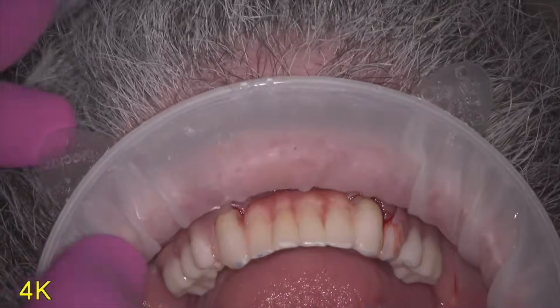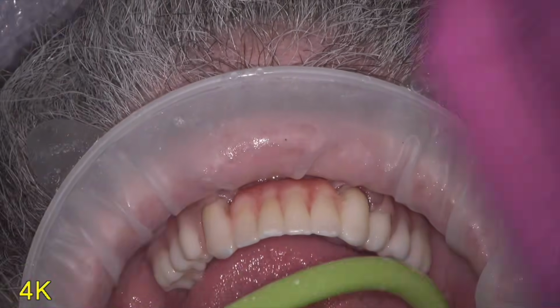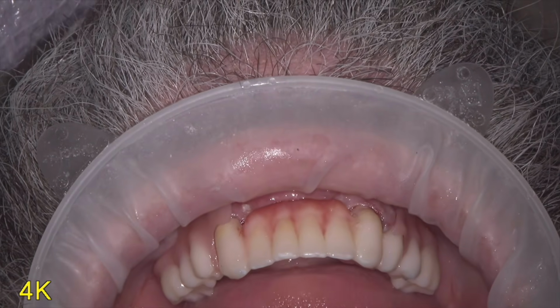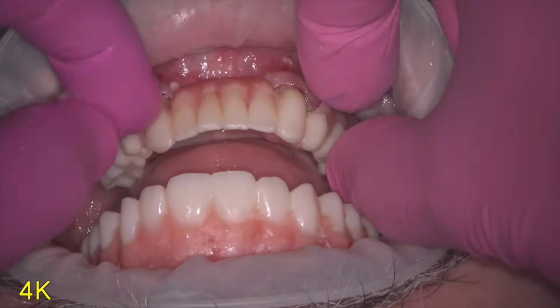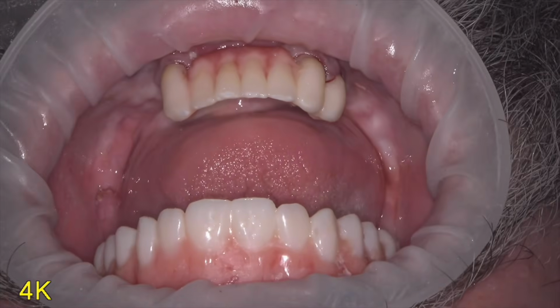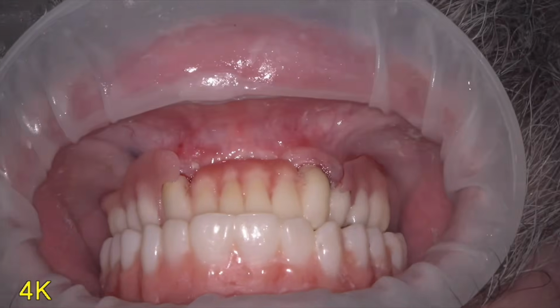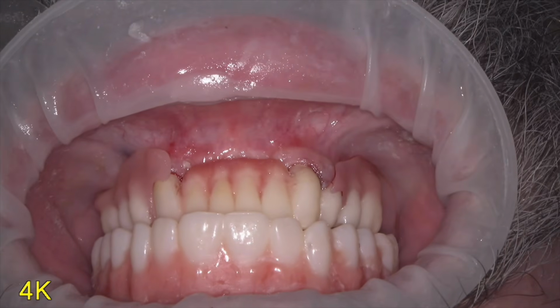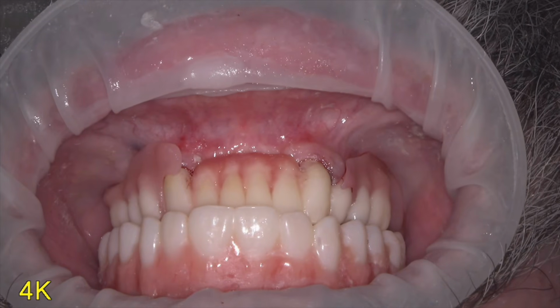Check the occlusion, and everything is beautiful. And I'm going to tell you, he was not expecting to have fixed teeth there in the anterior. He was in heaven. So look, that thing just fits perfectly. It snaps in. The bite is totally perfect. There's no adjustments needed. Clasps fit good. Bridge fits good. Everything is in perfect occlusion.